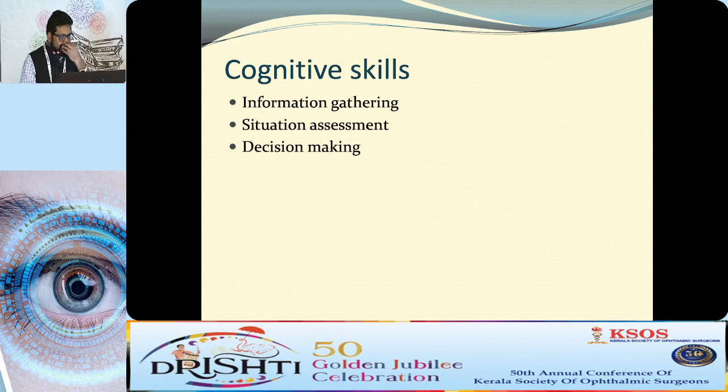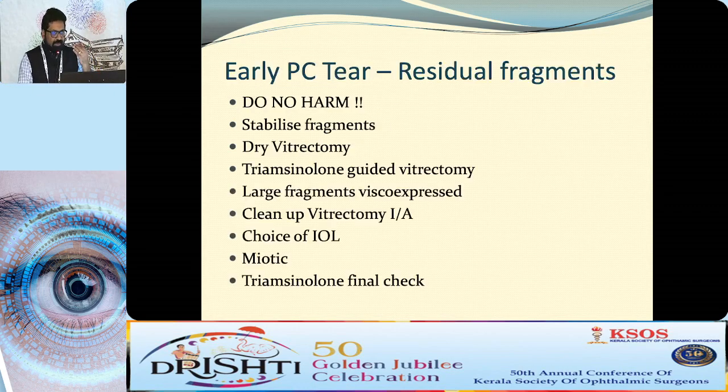do an OVD exchange, take a minute, gather the information, okay, what exactly is going on, assess the situation, take a decision. If you are a God-fearing man, you can even pray for a minute and then take a decision, have a plan, and then go ahead. So if it's an early PC tear, the first thing is do not harm, do not cause more harm.